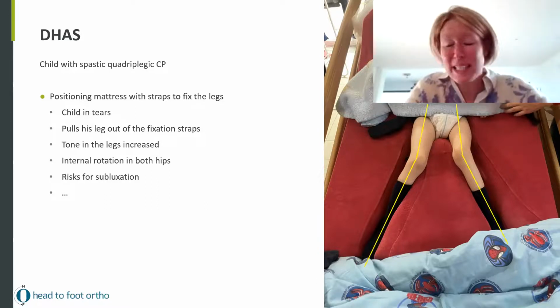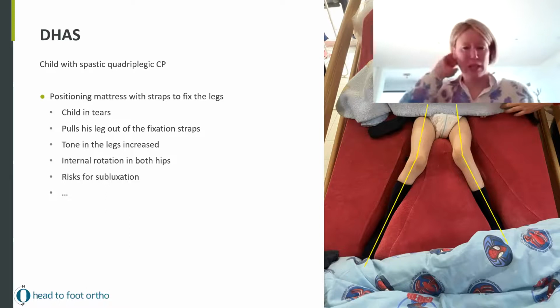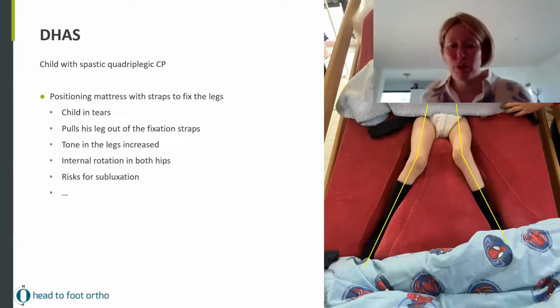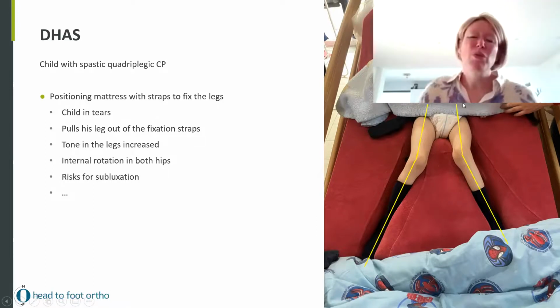So that's why this is static positioning. This is why I'm not a big fan of static. And it's really sad to see that we try to maintain that abduction in such a static position. If you look correctly at how he is now in that mattress, he has that internal rotation of the femur. You don't see it really well, but equinus on the foot. You have risks for subluxation of the hip. So it's really not the best position you want.